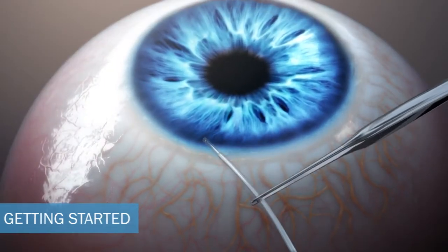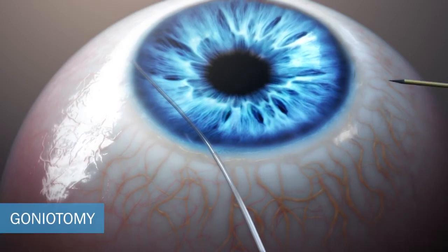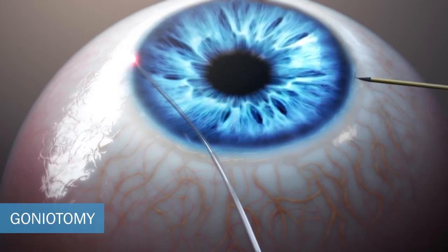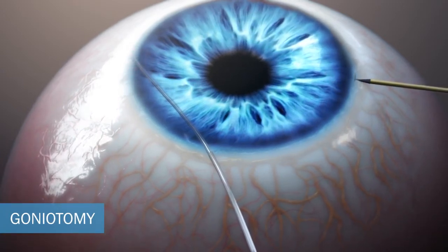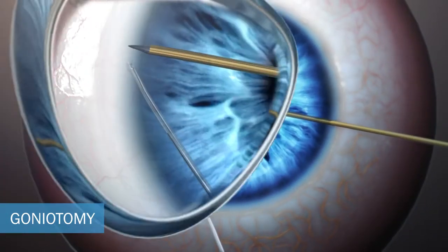The EyeTrack is then placed through the side port incision. Using the RPT all-in-one forceps, the surgeon will enter the anterior chamber through the keratome incision and traverse until the tip of the forceps reaches the trabecular meshwork.